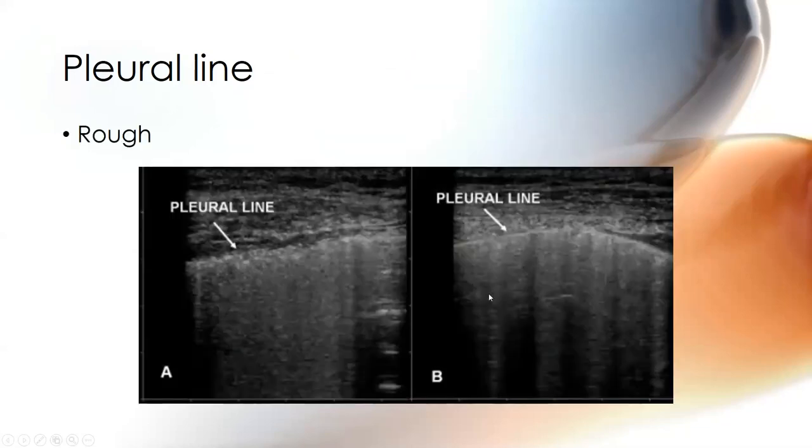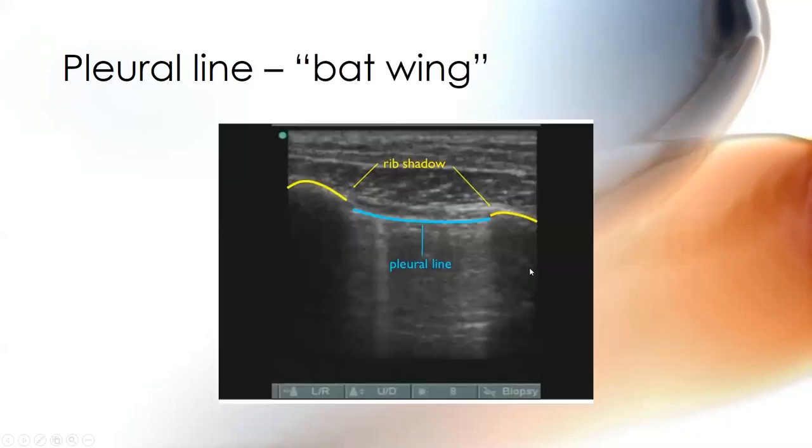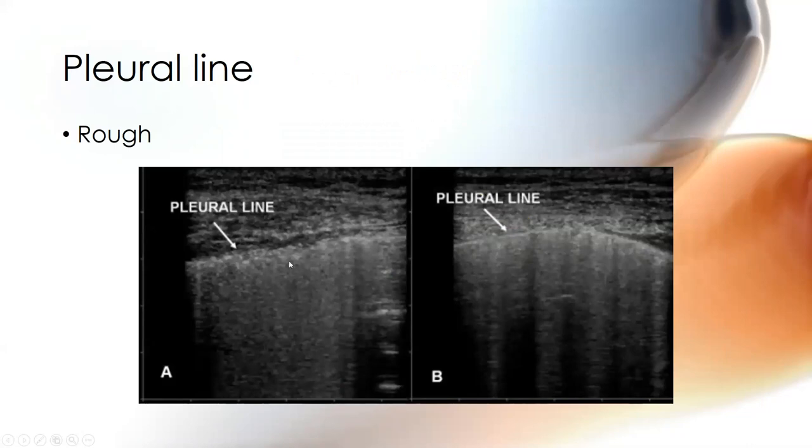More examples of pleural lines, but you can see they look very different than this one. Nice and smooth, pretty healthy. I don't have any motion here, but we'll see how it's supposed to move on other slides. These are lumpy bumpies. Lumpy bumpies could be pathologic. So when you're scanning, if you have an institution that's going to use this for your assessment, which is very within your scope, I would advocate for using that. You could create a note template that said pleural line smooth, slides, we'll talk about sliding lung, or pleural line rough. And the doc or the medical team can start interpreting whatever it is that you're looking at.